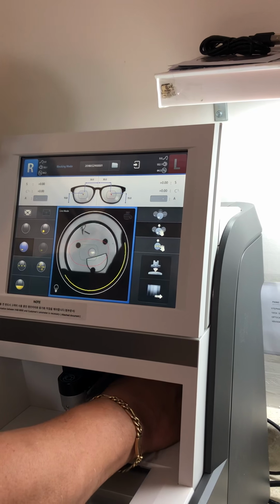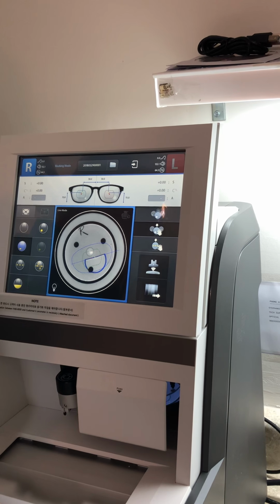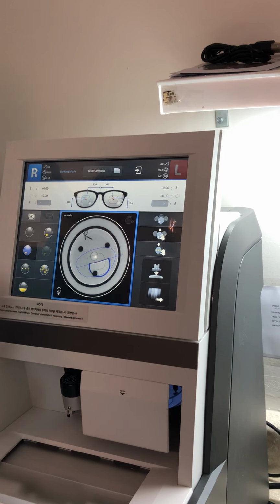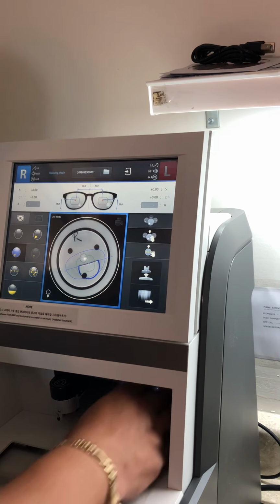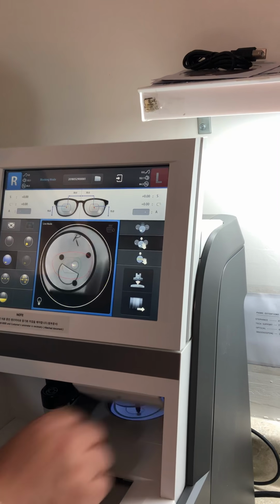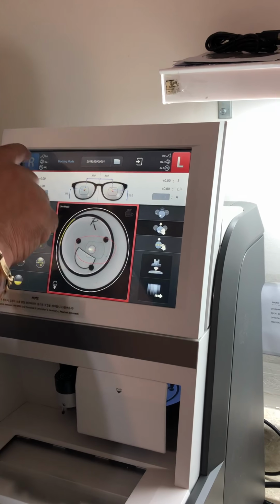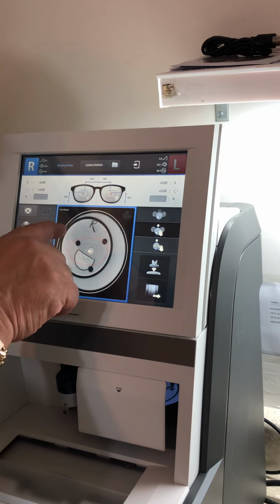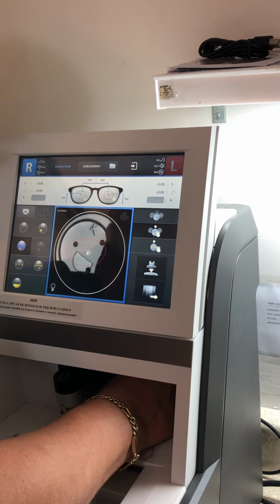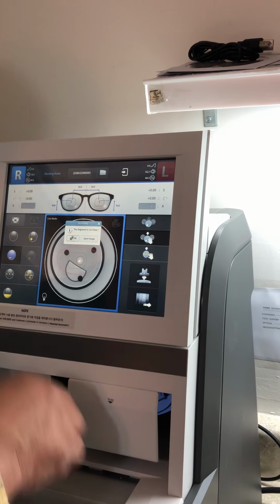He's too close. What it's doing is it picks up the light reflection from the shelf of the bifocal. So I want you to move them further away. You like that, huh? So this kind of takes away from having to do it manually. He knows that it's not going to cut out. So he wants it. Segment height, it's just not clear.